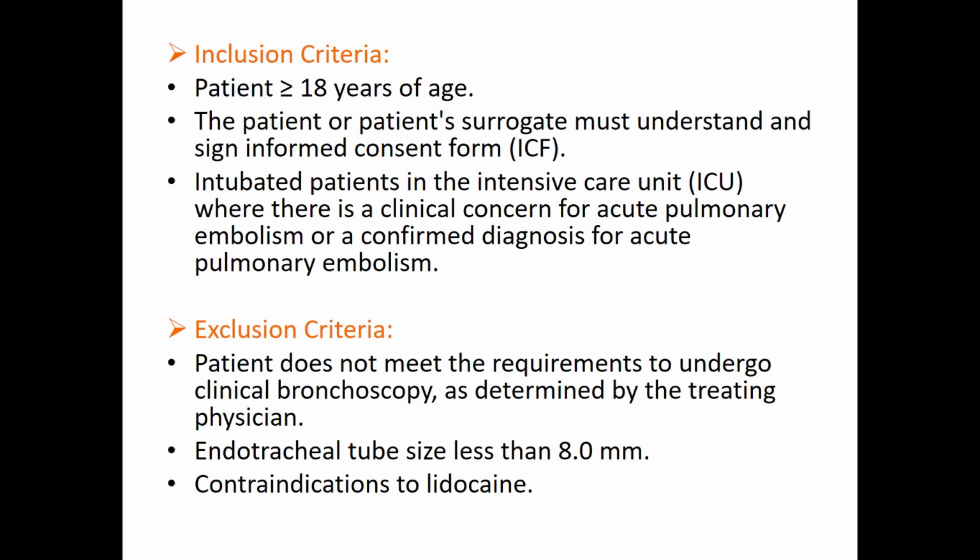In this study, we can see the exclusion criteria are more or less the same as those for doing bronchoscopy. That is, practically, unless the tube size is less than 8, you can do EBUS in all those critically ill patients.